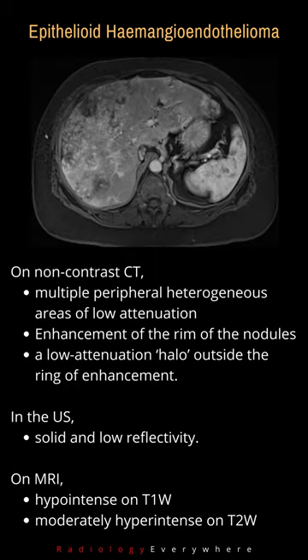On non-contrast CT, the lesions are seen as multiple peripheral heterogeneous areas of low attenuation. There is enhancement of the rim of the nodules, with a low attenuation halo outside the ring of enhancement.